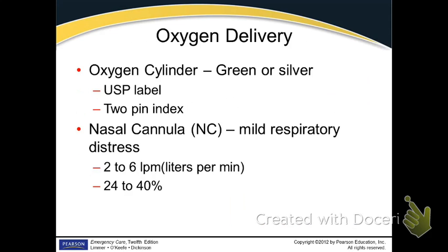All right, let's talk about the first adjunct. Everybody's probably seen these, at least on TV. That didn't work. So much for that. The nasal cannula. All right, or it could be used as a jump rope if you get really bored. Let's see. Too close. Alright, so good cardio workout, or good for oxygen.